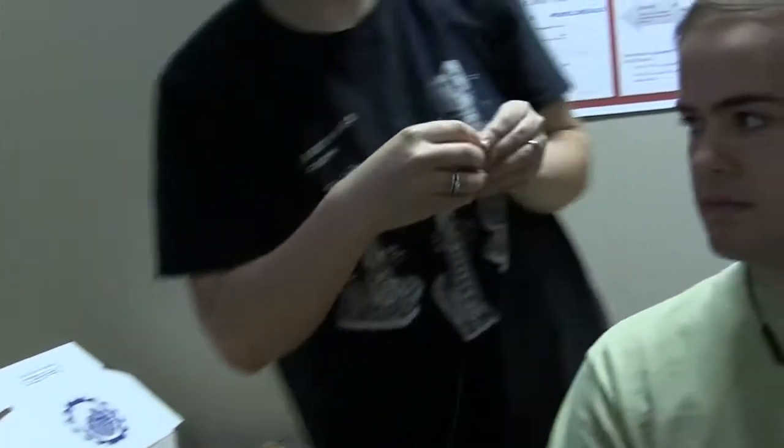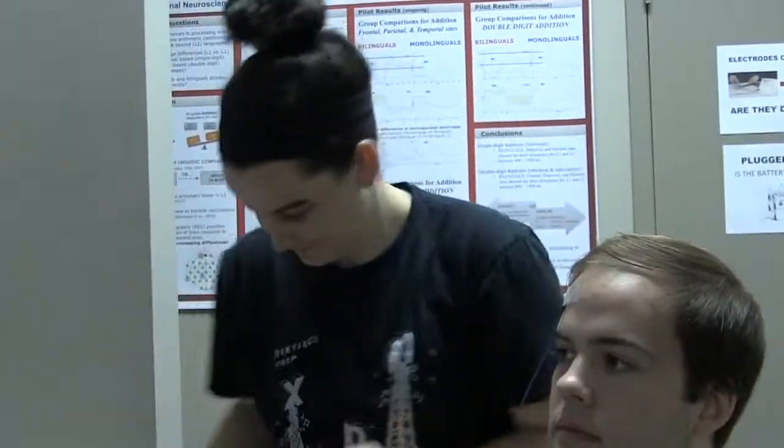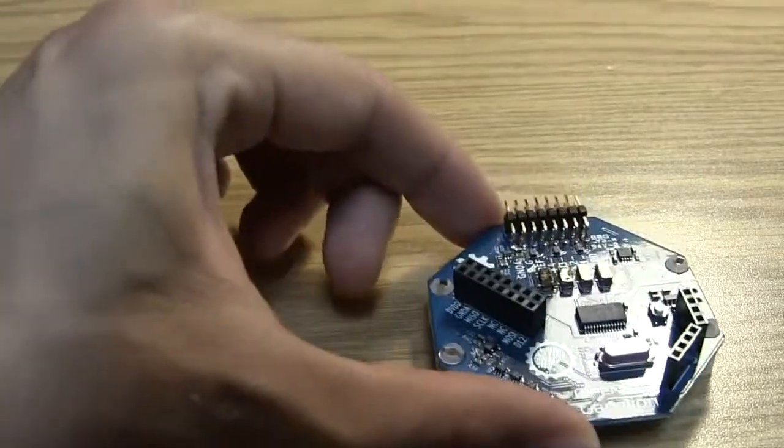A brain-computer interface, or BCI, is a device that measures central nervous system activity and then converts that into some output that replaces, enhances, or substitutes a function. The BCI we decided to use for this project was the OpenBCI Ganglion board.